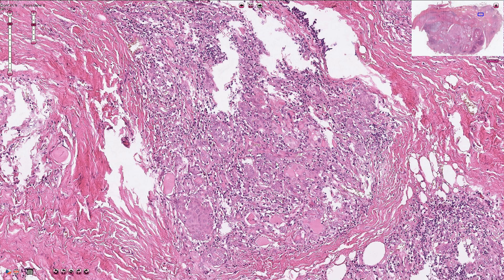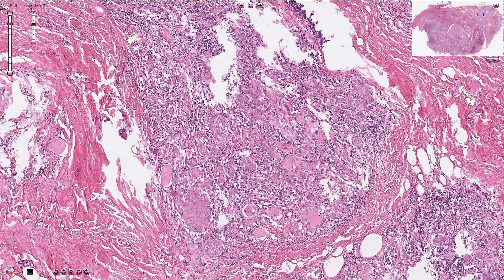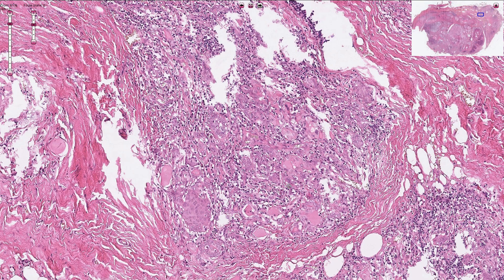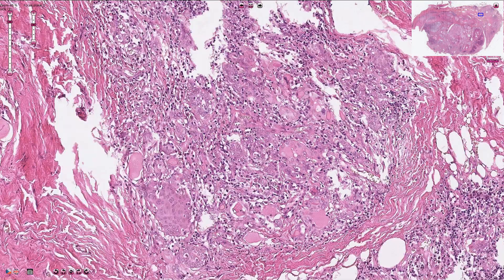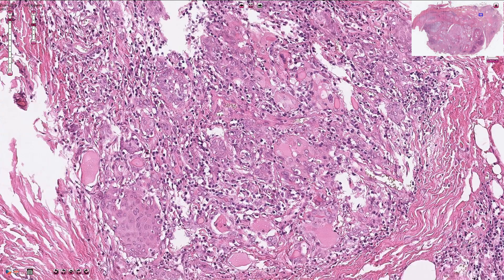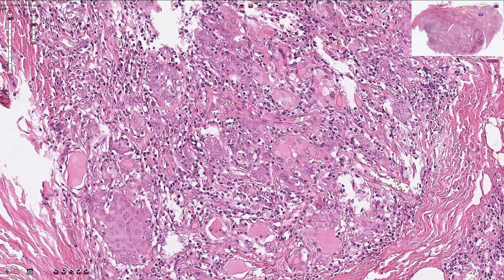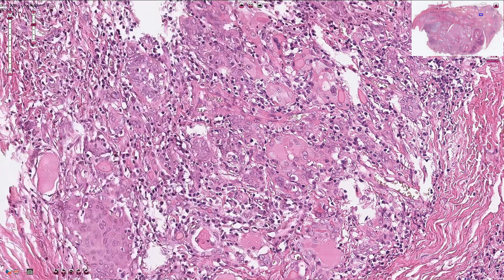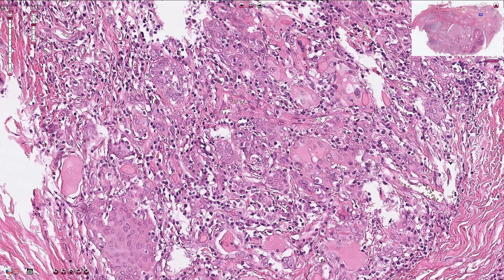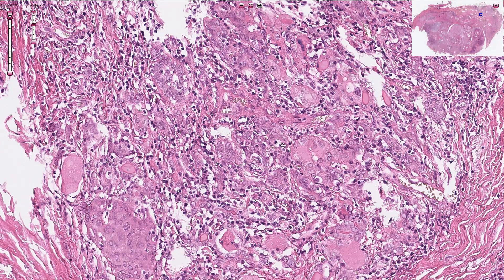On higher magnification, we can appreciate some typical features of Hashimoto thyroiditis. The thyroid follicles are atrophic and only some of them contain colloid. There is interfollicular fibrosis, and all of these darker smaller cells are lymphocytes that diffusely and dispersely infiltrate the thyroid parenchyma.